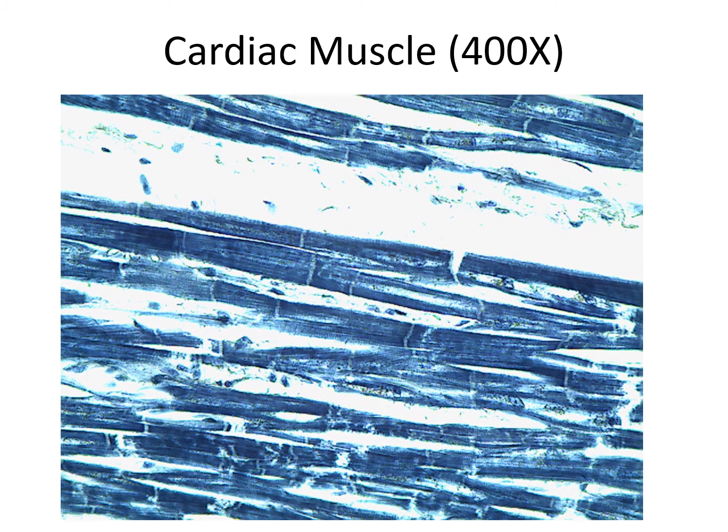Cardiac muscles. Our cardiac muscles look very dark, but you can see this structure over here, this is the intercalated disc. Also, you can see that the cells kind of branch. See, they're not tube-like. They do have some branches, and they are striated. So here we have striations. And uninucleated, one nucleus per cell. Cardiac muscles are found only in the walls of the heart.